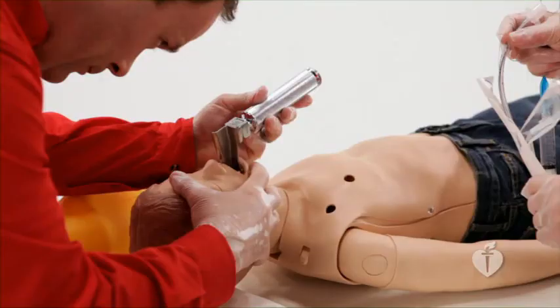When the epiglottis is visualized, the tip of the blade may either be placed into the vallecula at the base of the tongue or used to lift the epiglottis directly. Lift the laryngoscope in the direction of the handle to expose the glottis. Do not rock the laryngoscope back and forth. Avoid pressure on the upper lip, upper gum, and teeth.